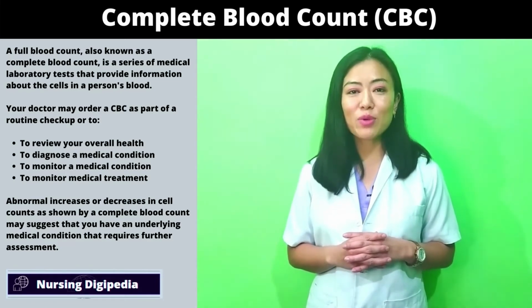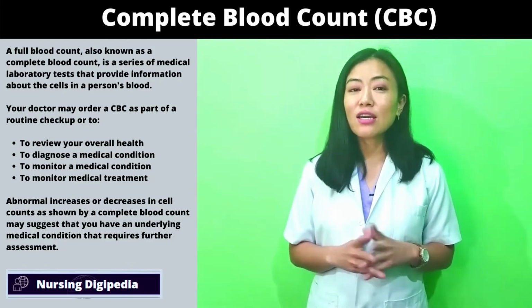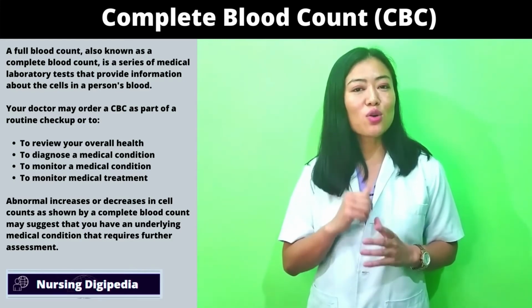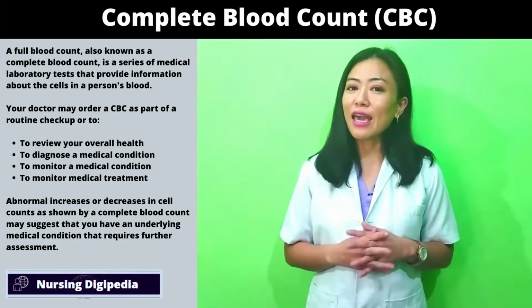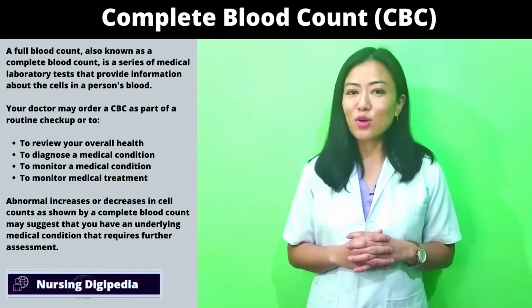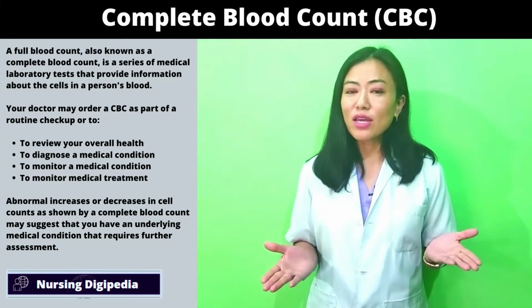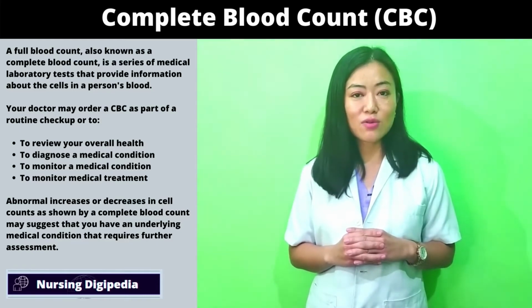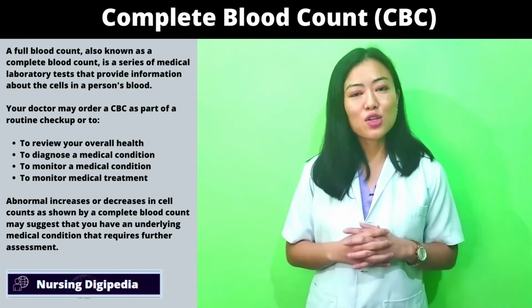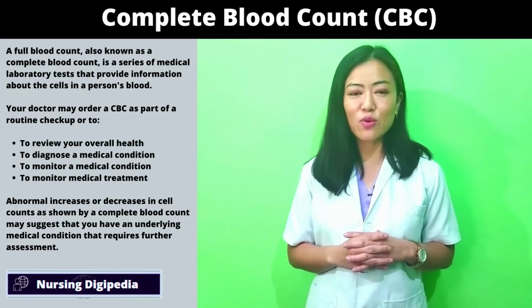Now, you might be wondering why a doctor requested this test. Well, it is commonly used to identify and evaluate your overall health, such as anemia, infection, as well as to detect and monitor a variety of health issues, as an abnormal increase or decrease in the cell count as shown in the complete blood count may suggest that you have an underlying medical condition that needs further evaluation.